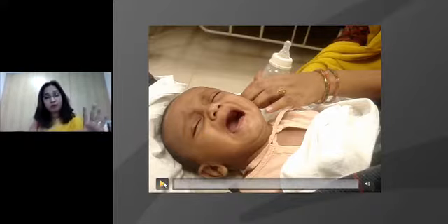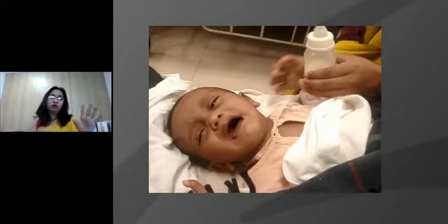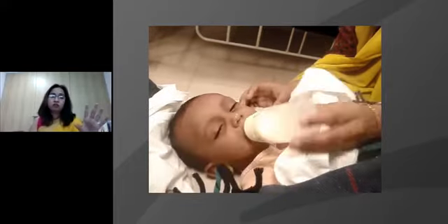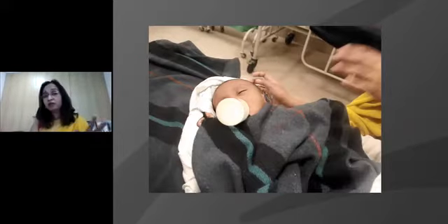Now let's see what happens here. Since it's 2 hours, I thought maybe he's hungry. So that did the trick. But the regional anesthesiologist in me is not quite sure yet, because he should not have cried in any which way, and I am curious to know whether the block acted.